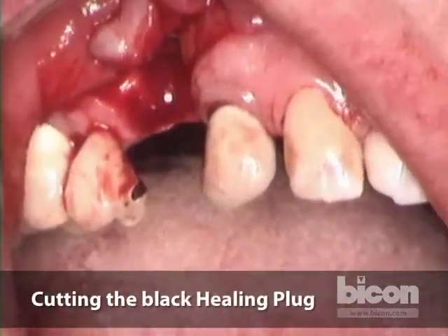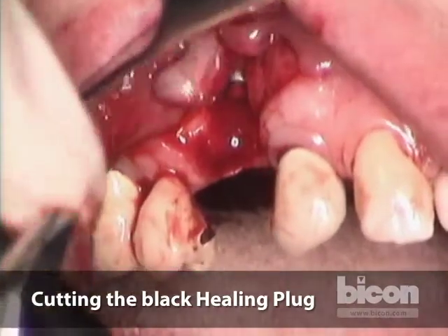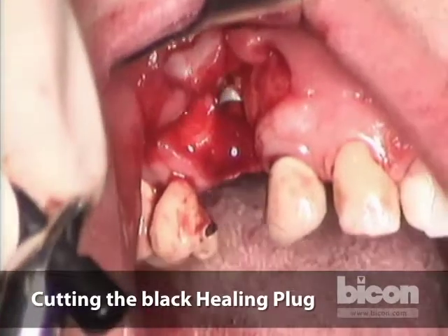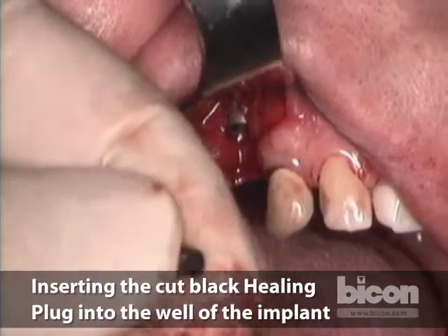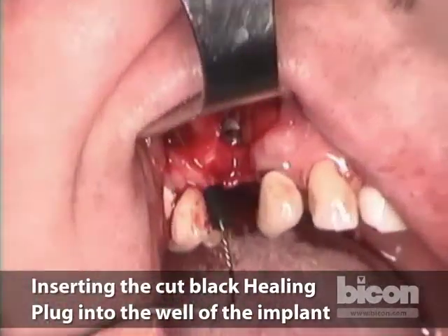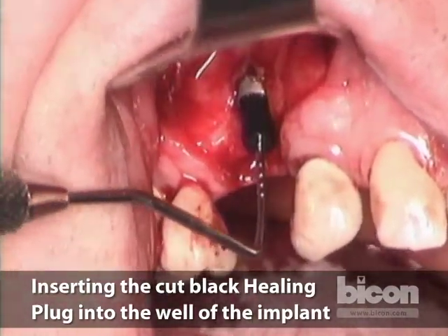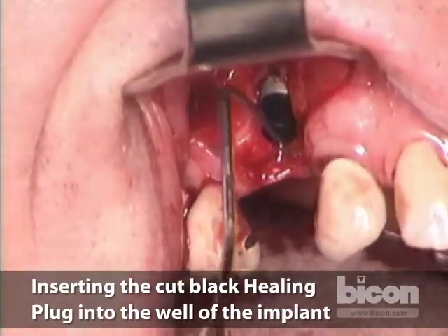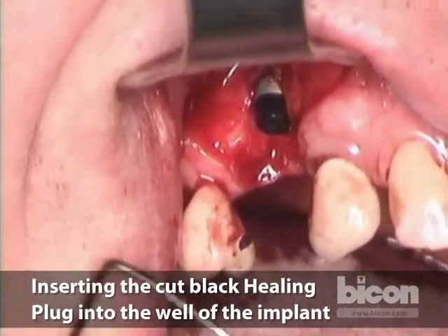So what we'll do is estimate where the healing plug wants to be relative to the bone adjacent to that implant. So we're going to go about 2 millimeters above the edge of the bone. There is a small hole inside the black healing plug, allows it to be draped over the periodontal probe, and then it is introduced into the implant well. We'll seat it fully. If it's still too high, we can always trim it. It looks pretty good.